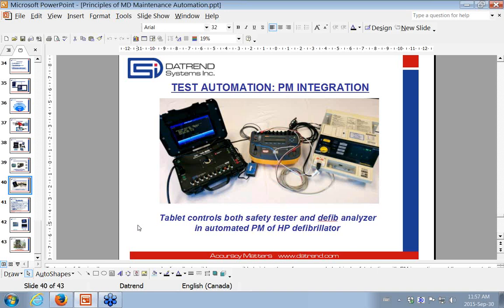Okay. Next question. How many procedures does the VPAD hold? Well, this is the thing about procedures. Fortunately, they're documents. Now we can actually go into procedures that are based on video. We have the capability to do that. But for the most part, procedures are documents.